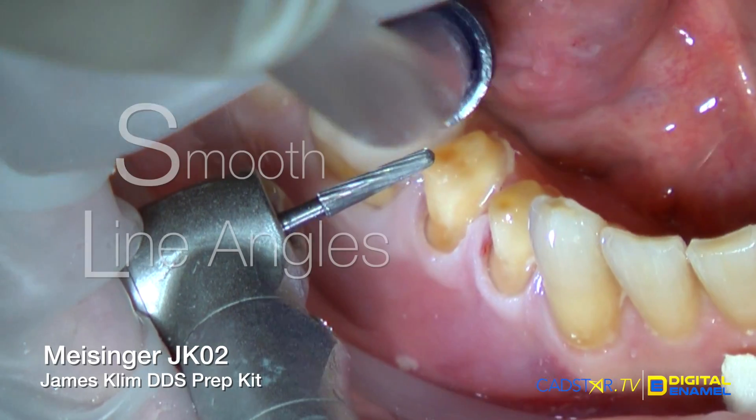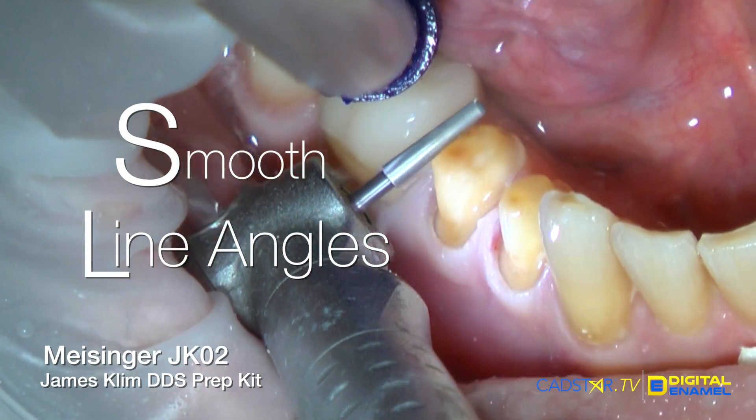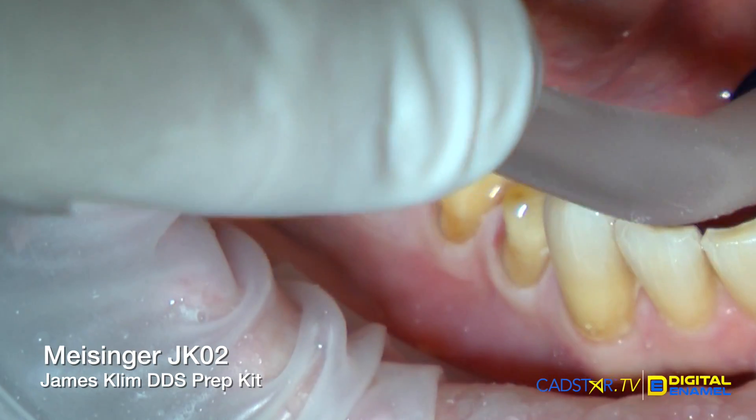I'll finish my margins and I'll smooth my line angles, and that's really important — to have smooth line angles where you transition from the occlusal table to the actual wall. When our preps are smooth, we'll see really nice smooth internal surfaces of our restorations, and that's really important to have that type of quality of mill for strength and longevity.